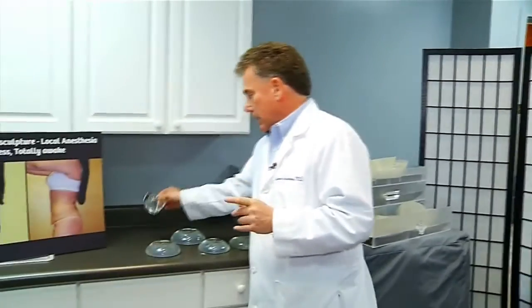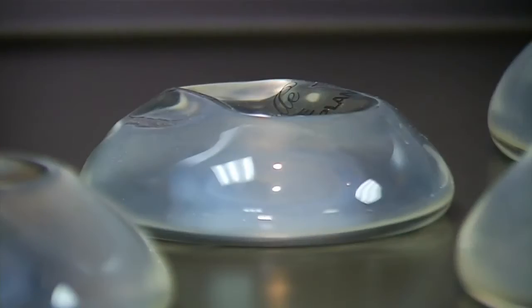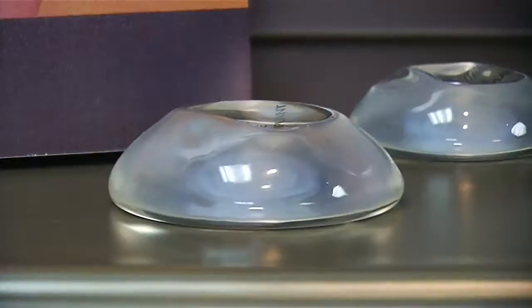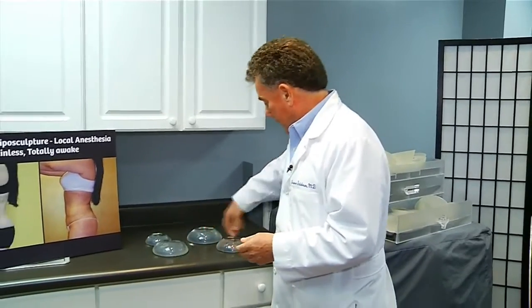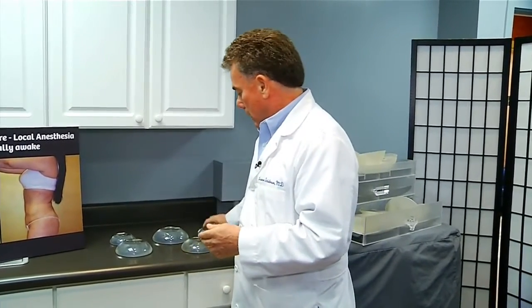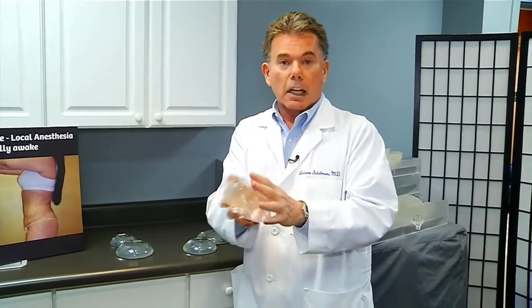Let me just show you. This is a 215 milliliter implant — this is a real silicone gel implant, just for illustration. This is about 375 — it's a silicone gel implant. This is all silicone; the inside is silicone gel. If it's not silicone gel, it could be saline, which is a liquid. This is a larger one, maybe 450. It comes in 450 mLs. And this is something like 550 mLs, so it's a larger implant.